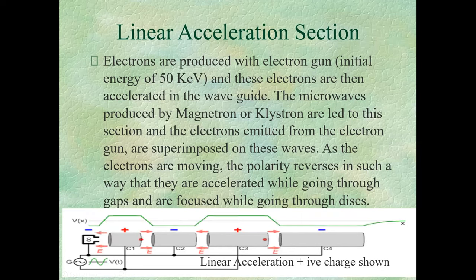So did that answer your question? Yeah, I think that answers the question. Yeah, thank you. So it rarely happens. It can happen weekly or monthly. It rarely happens, but when it happens, we are definitely not giving uniform radiation, and we may be treating wrong.